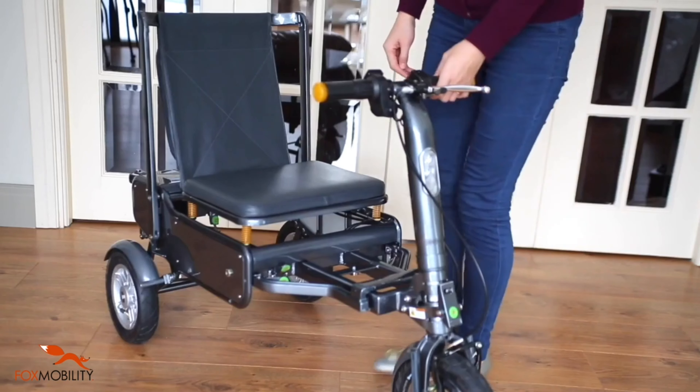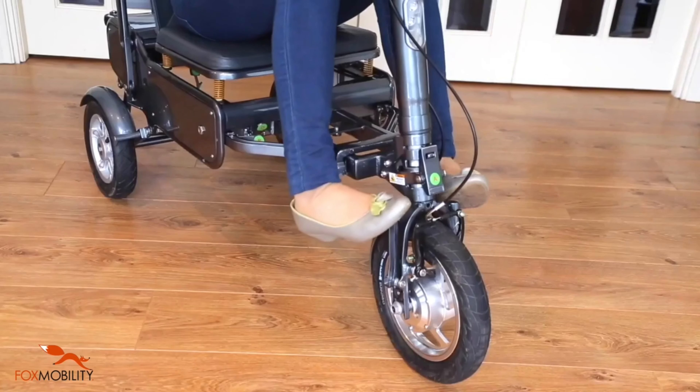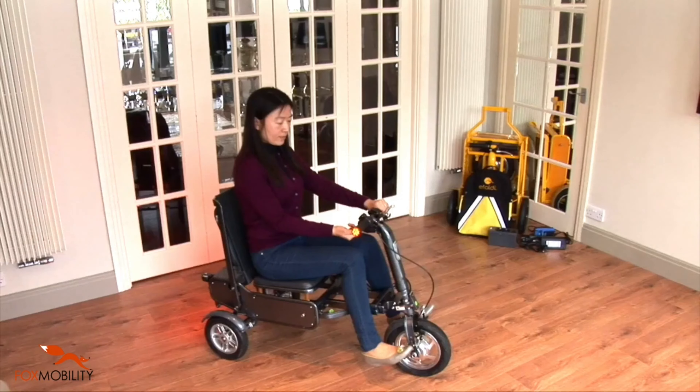Raise the seat's backrest. Now you can sit on the eFoldie. Unfold down the two foot rests and now you are ready to go.